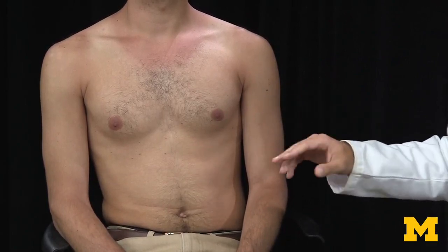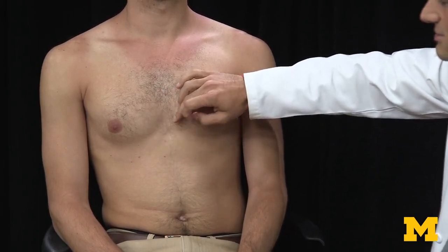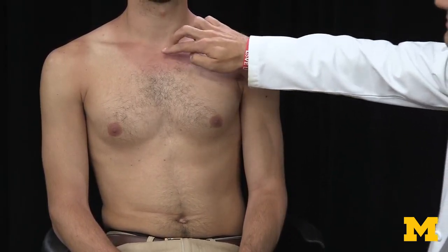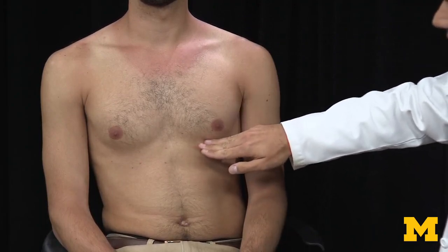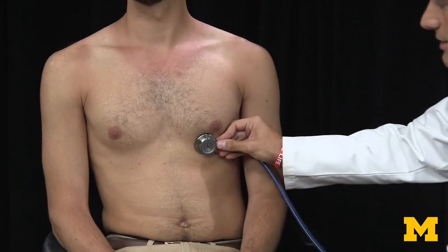The final valve is the mitral valve — also called the bicuspid or left AV valve — located at the fifth intercostal space at the midclavicular line. The midclavicular line is halfway between the sternum and the acromion. On males, the nipple can be used as a landmark, so you place the stethoscope immediately inferior to it. Like the tricuspid, the mitral is S1-heavy: LUB-dub.